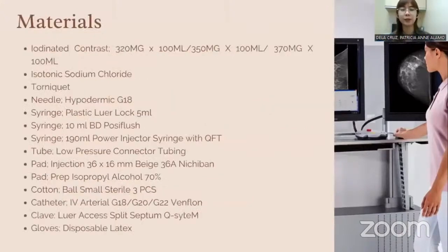So here are the materials that we're going to use. I listed them down here. Most of these are what we're going to use in conducting IV insertion, because we're going to provide IV access so that we can inject the contrast.